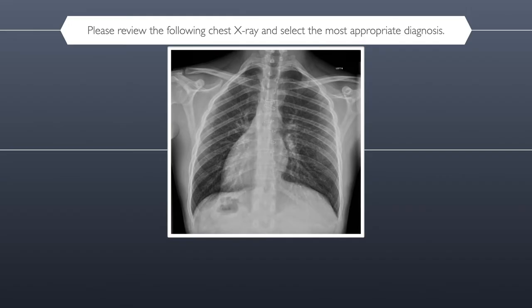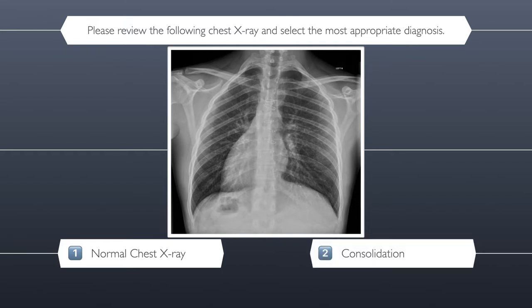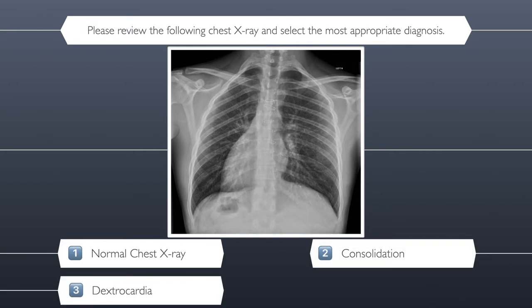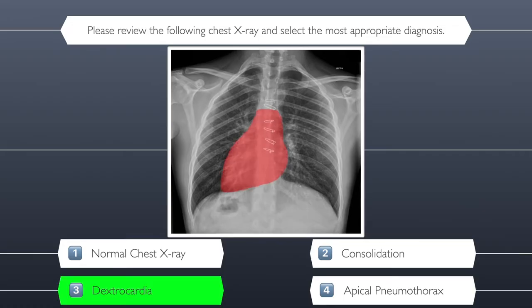Here are your four possible answers for question four: is this a normal chest x-ray, consolidation, dextrocardia, or apical pneumothorax? The correct answer is dextrocardia.